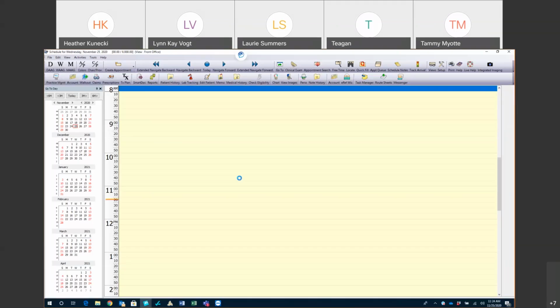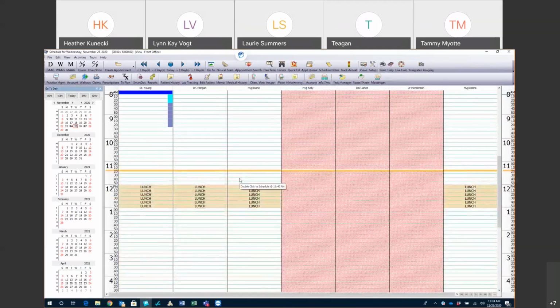And Tom is going to be coming into your office on January 4 once you get Eaglesoft installed, and he'll run around and make sure all of the sensors are installed on the computers for you. So that way you don't have to do it.